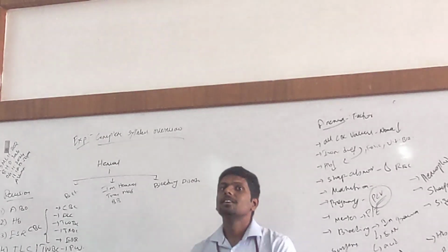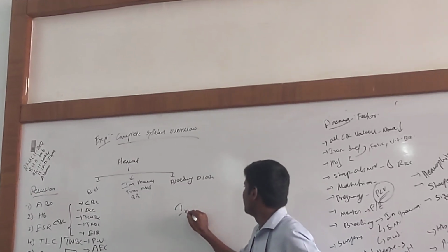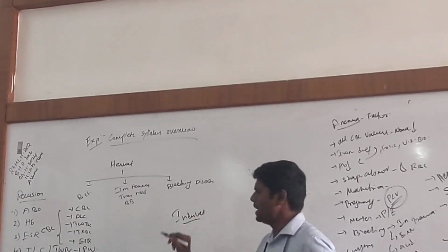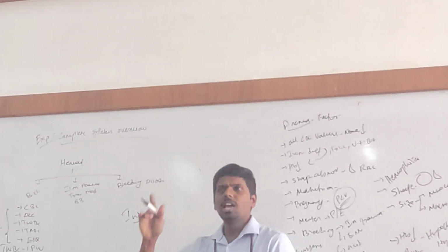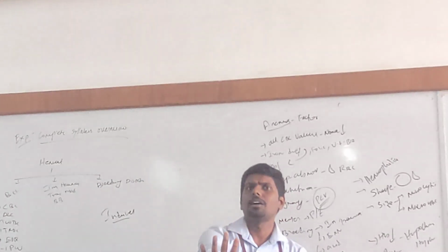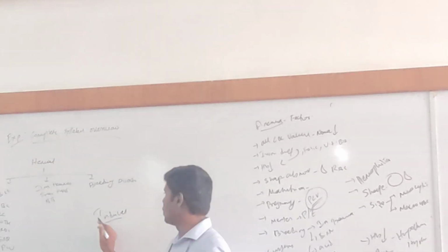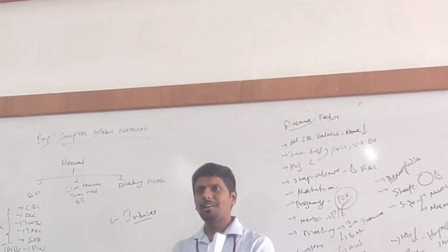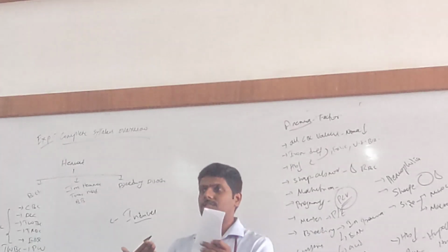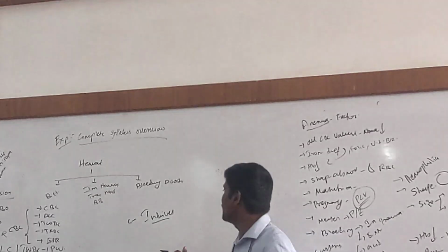Now listen. For indices, we need a group of lab tests. If we have these lab test data, we can measure the indices. What lab tests do we need? The materials required for indices, I'm giving you a very normalized example. It's not the ideal list, but anyway.